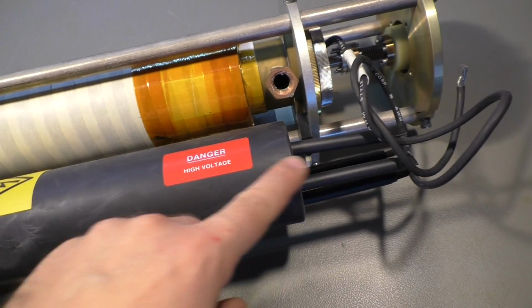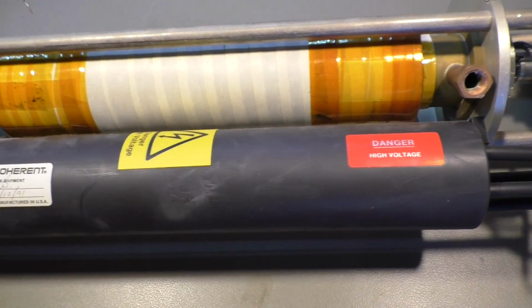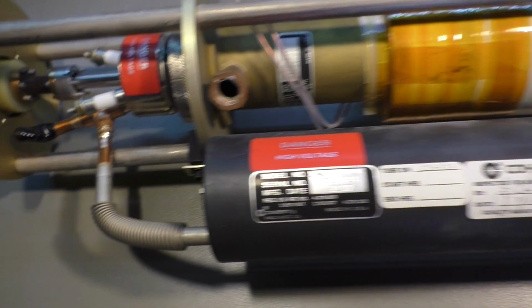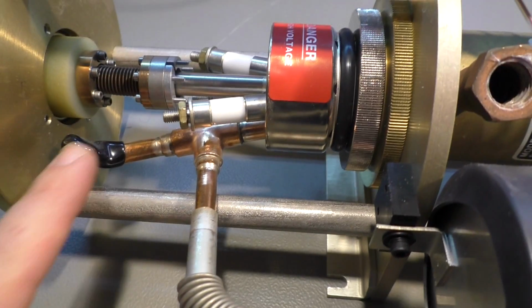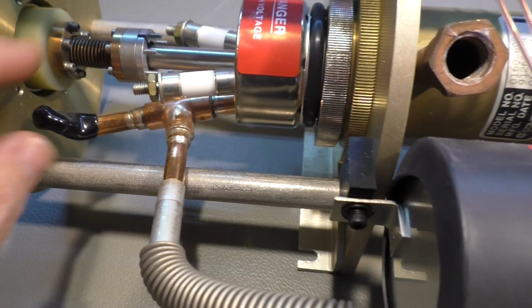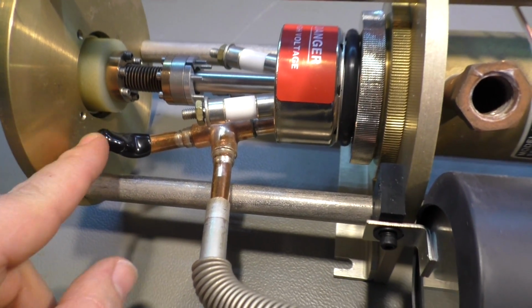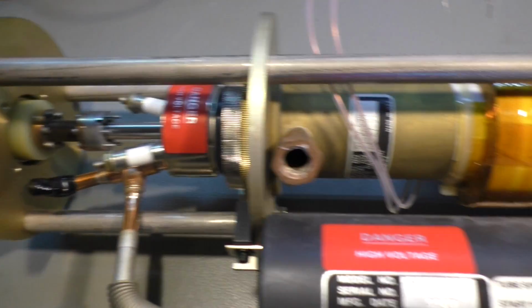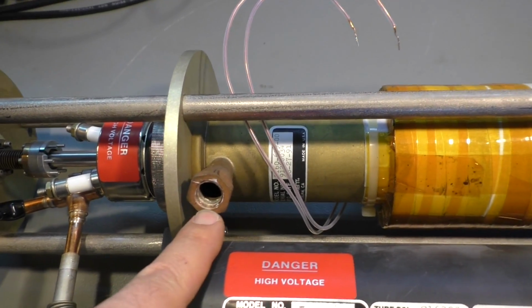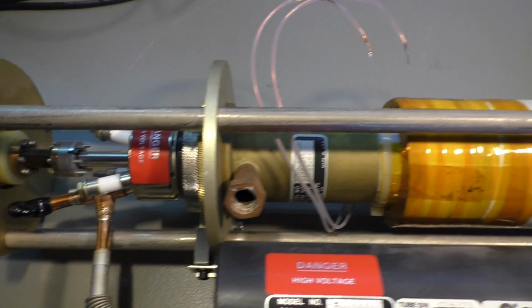Then we have here a reservoir tube. It's just a metal tube that is connected to the filling port here. This side is soldered or welded airtight after filling. We have a water in or out, depending on which way you want the water to flow.